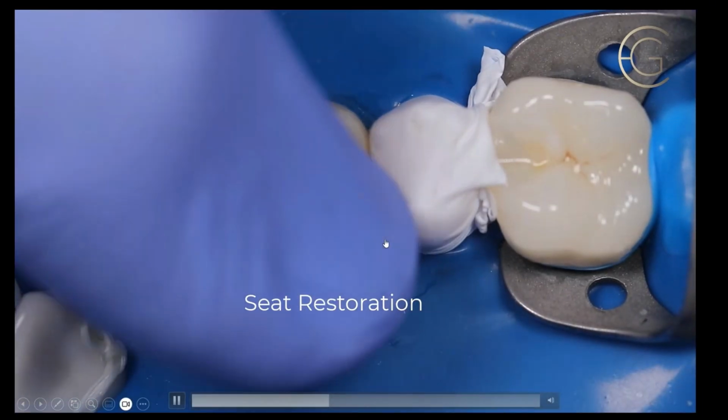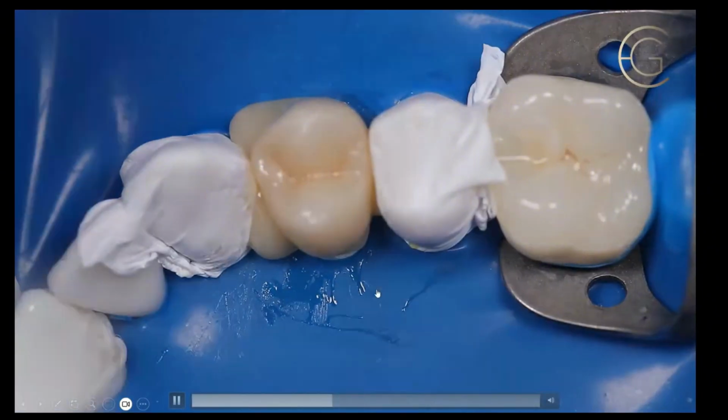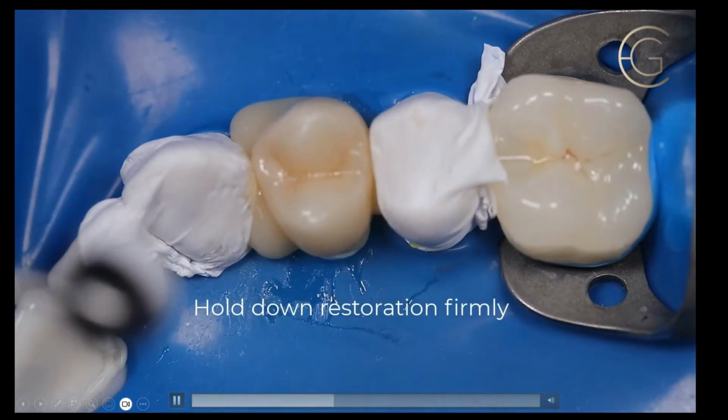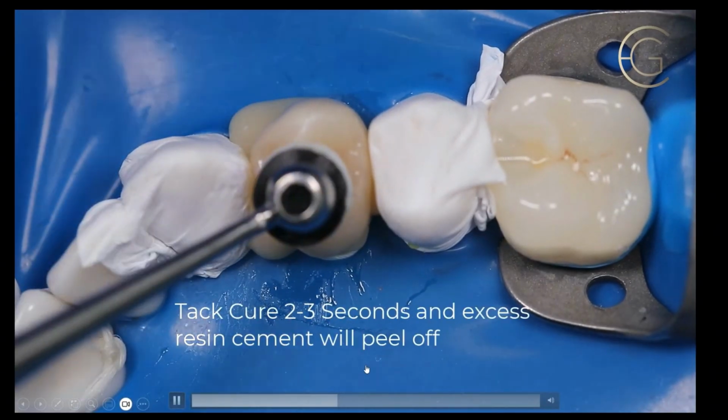You see that there's no weepage. I put this in. This is a Katana. It's not filming very well. The tooth that's on the molar is also a Katana, in different shades, obviously. I'm going to hold this down. I'm going to tack here.